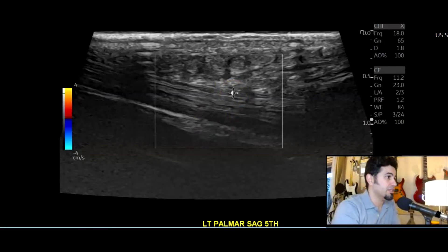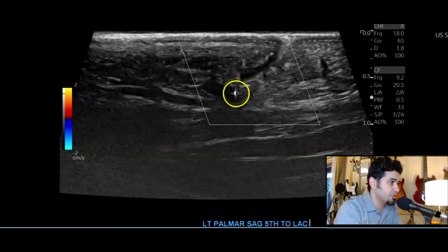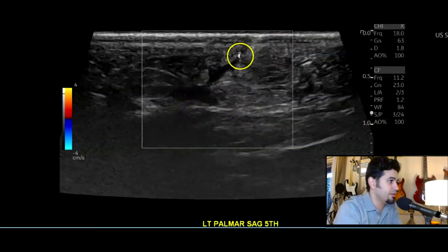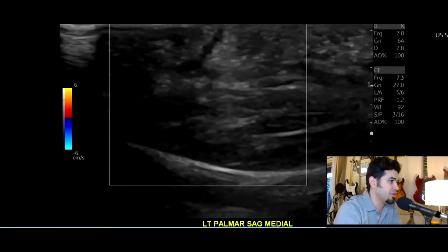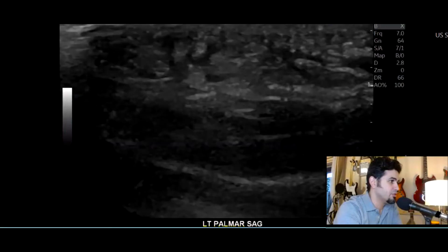Just lateral to that — which would be the medial hand in anatomic position — you start to see where there's a laceration right there. This is mostly in the subcutaneous fat. You see a little bit of fluid there in the laceration. Color Doppler shows no flow — good to do color Doppler in the area to check the palmar arteries and make sure there's no palmar artery injury or pseudo-aneurysm, which there wasn't.